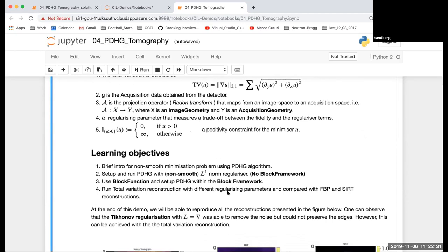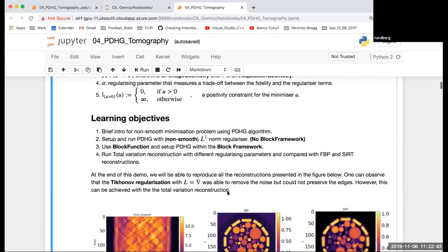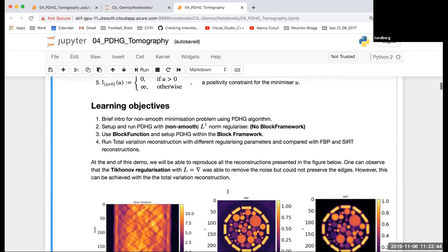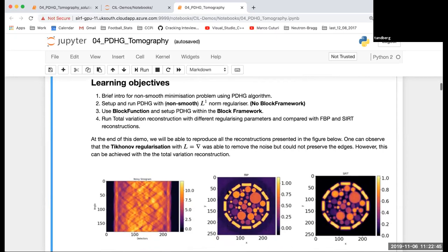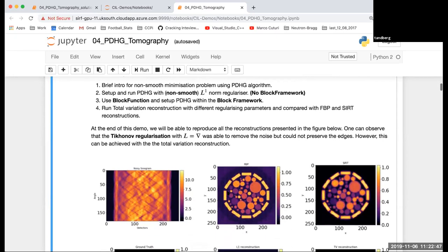The last two demos were about Tikhonov regularization and the operator was either the identity or the gradient. And here we'll use the total variation regularization.